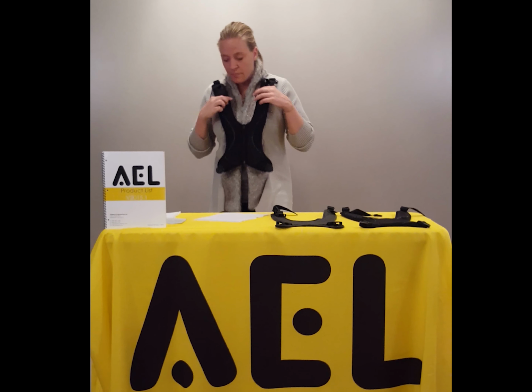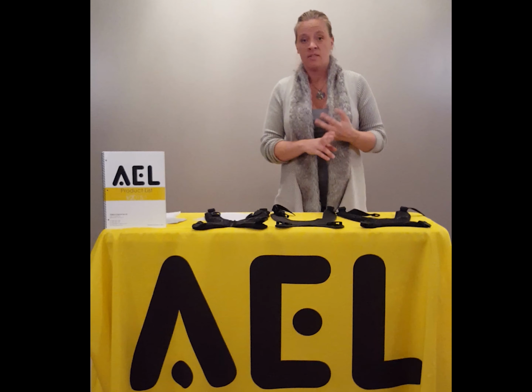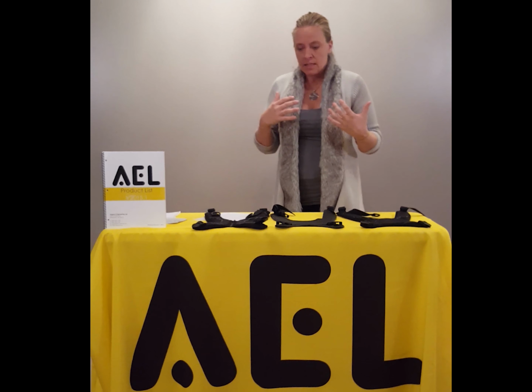Any of these options may be used with any of the diagnoses that we talked about during the standard cut versus slim cut tutorial. And those diagnoses include spinal cord injury, multiple sclerosis, muscular dystrophy, cerebral palsy, hypotonicity, any situation that presents with decreased trunk control, poor core strength, and a lack of general seating tolerance within the chair.